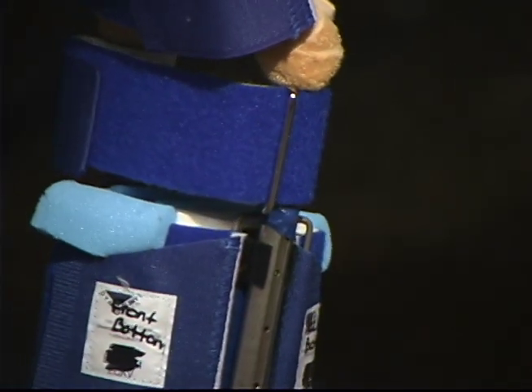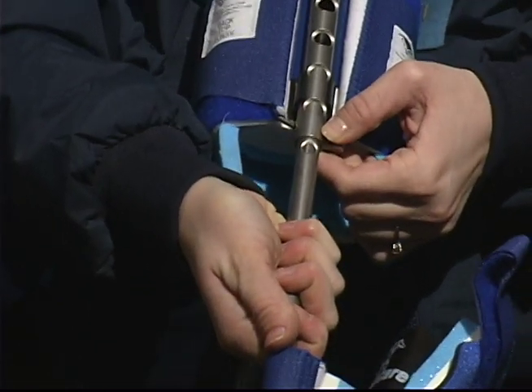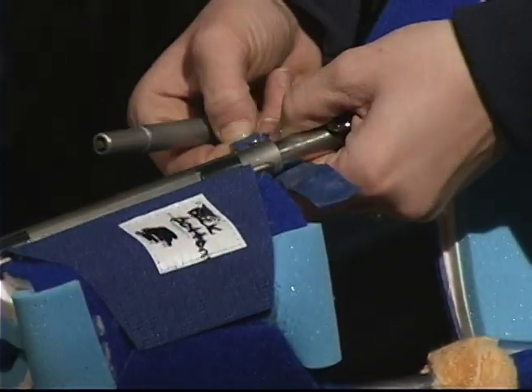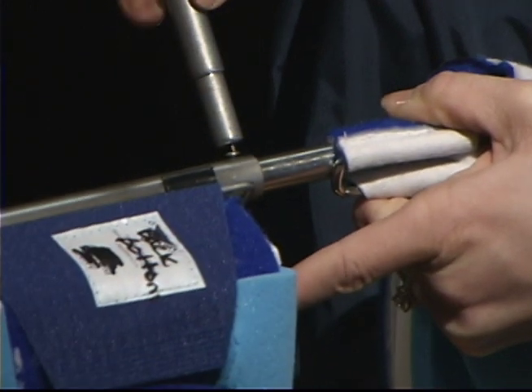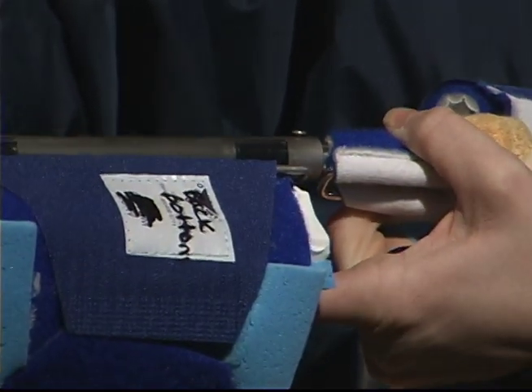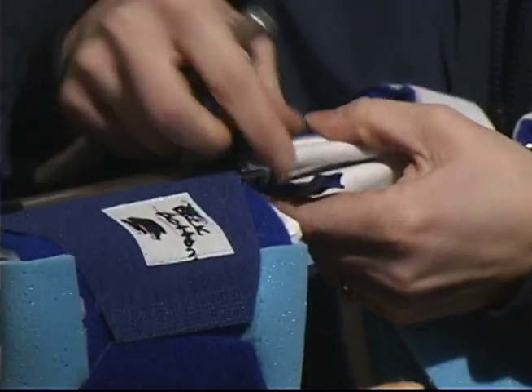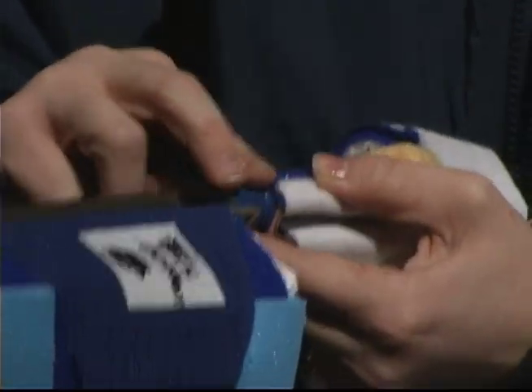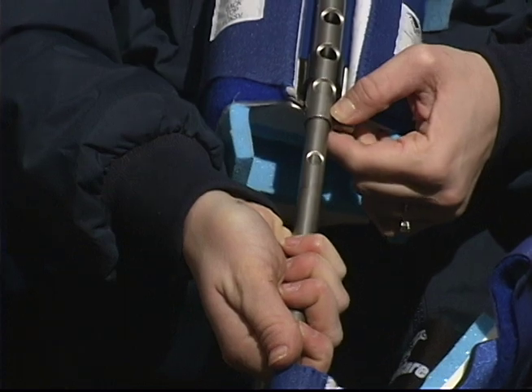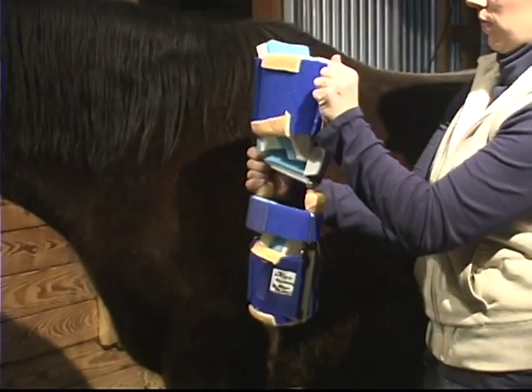To adjust the length of the struts, you will find set screws covered with electrical tape, or a pull pin and lock adjustment on the proximal and distal struts. First remove and save the electrical tape. Loosen the set screw by turning to the left — only a few turns so it doesn't fall out. Slide the tubes within each other to the desired length and then tighten. Using the electrical tape, recover the screw to ensure the screws do not walk out. What you do to one side, you must do to the other. Some Dynasplint systems have a pull pin and lock adjustment — simply pull and move the tubes to the desired position until they click in place.